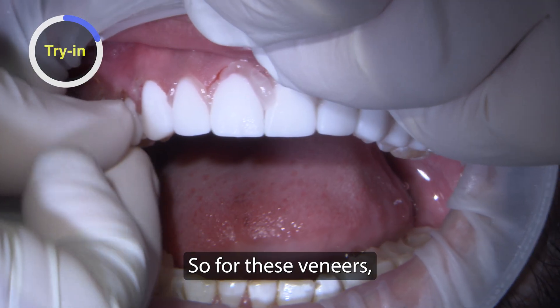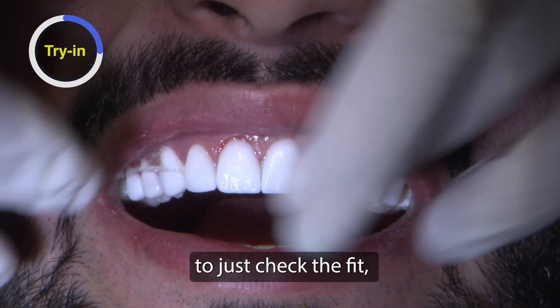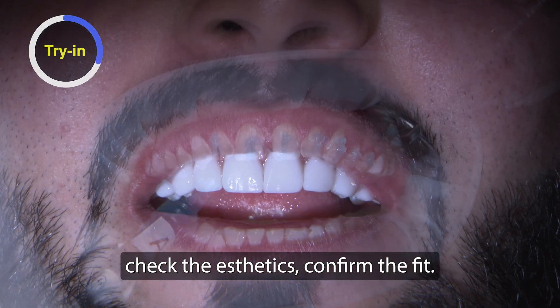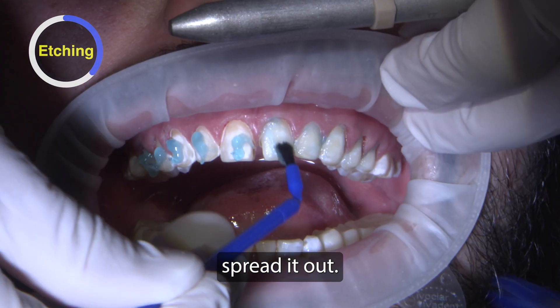For these veneers we always go through a try-in process. We're using try-in gel to just check the fit, check the aesthetics, and confirm the fit. Then we go through our bonding protocol — we drop our phosphoric acid on and spread it out.